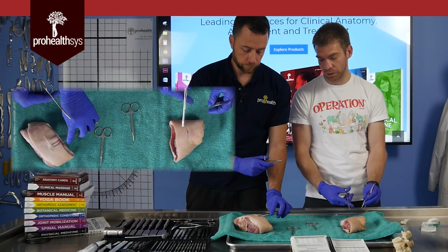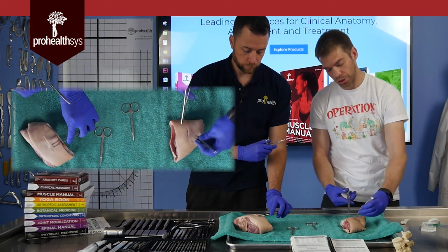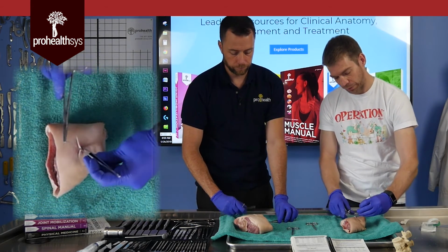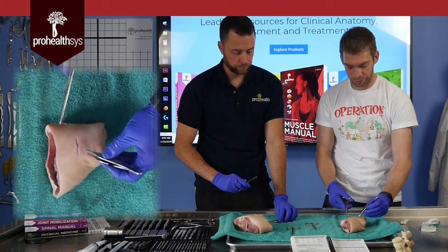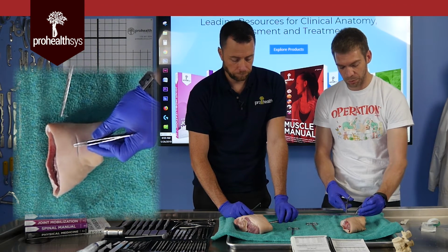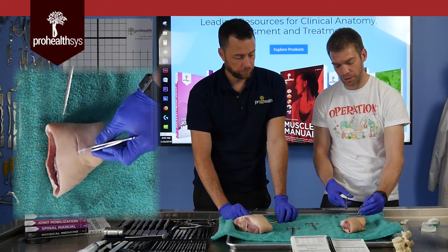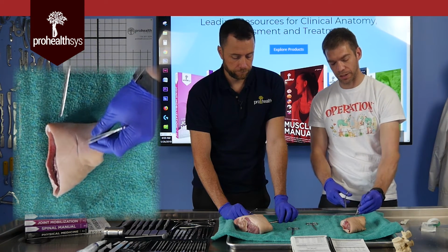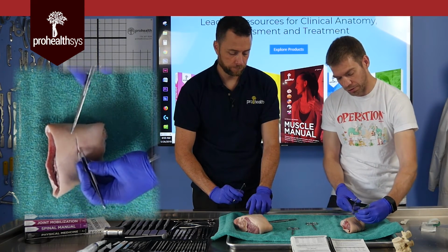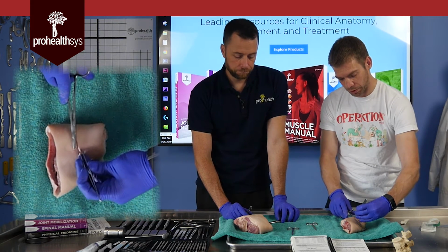And you know what? It is absolutely mandatory to go through like that, because once you close that laceration, you're not going to have the opportunity to grab it here and open it up. You'll have sutured it shut. But I have the luxury of doing that right now. So what I'm going to do, I'm going to try to come out right, make it so that we've almost got like a cross, where the angle of the suture is going to be exactly perpendicular to the angle of the laceration. So this is tricky, and those of you that do a little bit of knitting, crocheting, sewing, or whatever are going to find you're just inherently better at this. Maybe even better than I am at this.